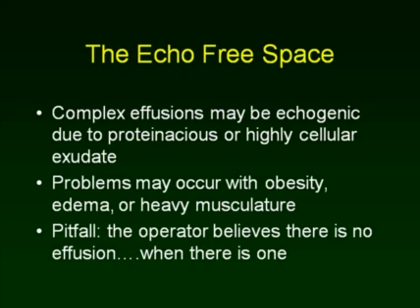But with highly echogenic pleural effusions, the operator may believe that there is no effusion when there actually is one. That occurs occasionally, but that's not a great error. The worse error is to believe that there is an effusion when there is no effusion.